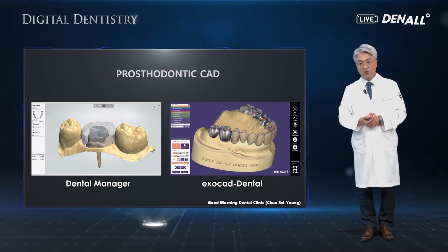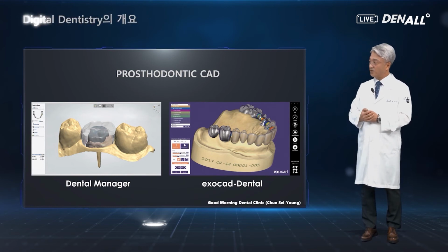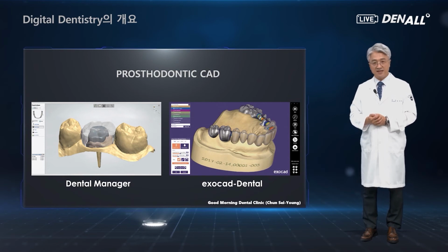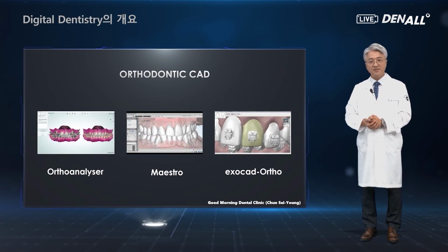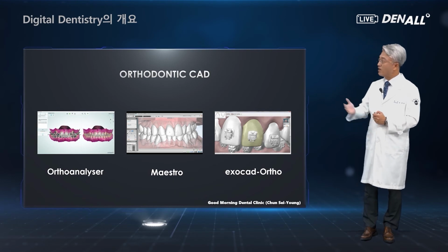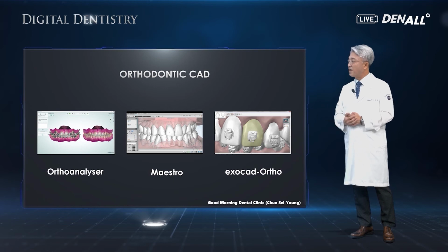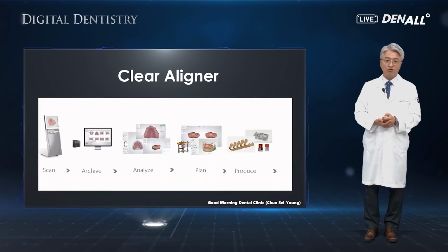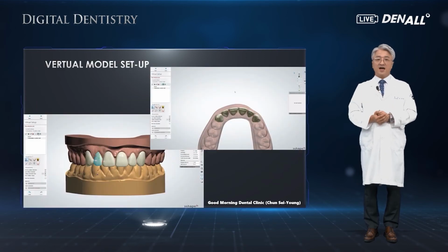First, prosthodontic CAD from 3Shape, Dental Manager, and ExoCAD software. They can cover inlay, crown, implant, prosthesis, and denture. So the software is used for all the designs. Let me introduce orthodontic CAD from several companies. 3Shape and Maestro products are used a lot.